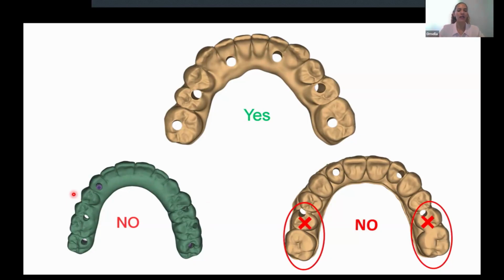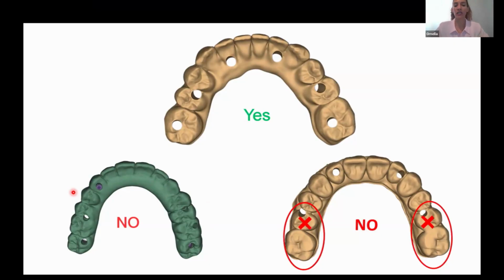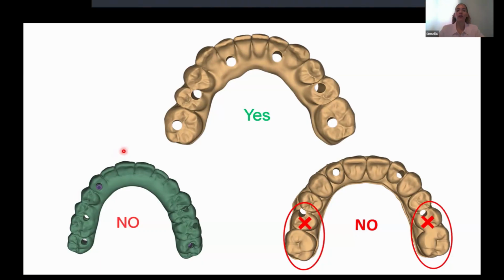A customer, again, called us: this graphene material, I don't like it, it breaks, okay? So in this way, I asked the customer to send us the STL, and obviously when I reviewed the case, I called him again and said, okay, doctor, you can be very mad, but you are not applying the recommendation from Grafenano, okay? You cannot put 6 pontics in the front area, okay?